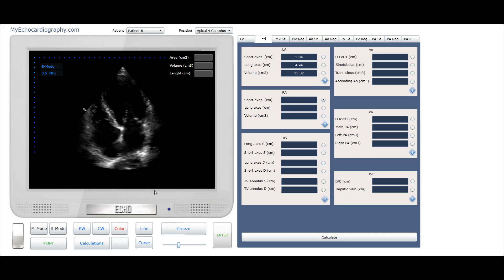In the tab measurements select right atrium short axis. Click the button line and start measurement of short axis of the right atrium. Click the button enter to save value.